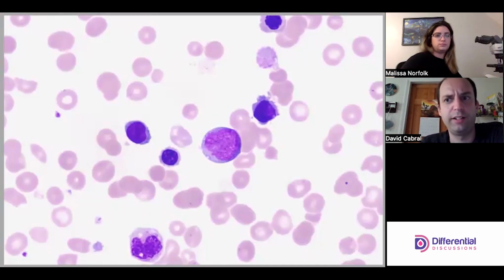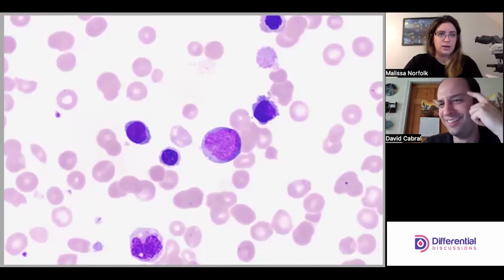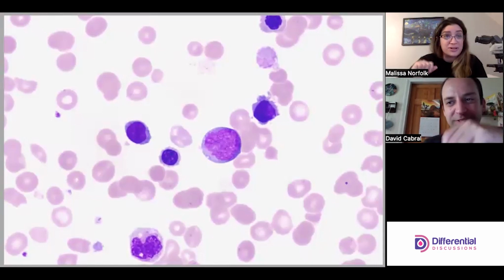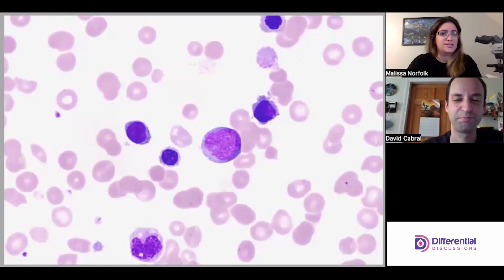All right, so we hit the major different abnormal cells that are in this slide. And again, I just want to reiterate, looking at M7s, each patient looks different. Even all the different ones I've seen through my career, every single M7 looks different. So it really is going to come down to flow. But what you have to recognize is that these cells are abnormal, which I think is fairly easy for this slide. We're going to put it to the side or give it to the pathologist, or whatever your hospital's policy is. So for us, it's really recognizing that they're abnormal.